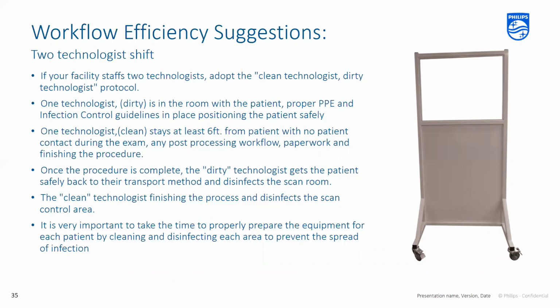back and disinfect the scan room. The clean technologist finishes the process and disinfects the scan control area. It is important to take the time to properly prepare the equipment for each patient by cleaning and disinfecting each area to prevent the spread of infection.